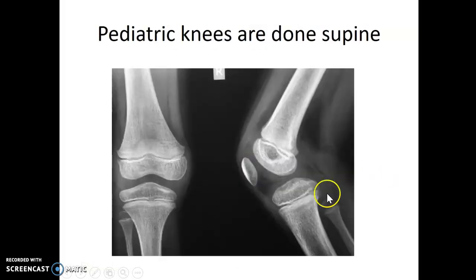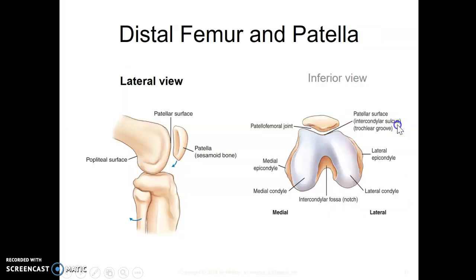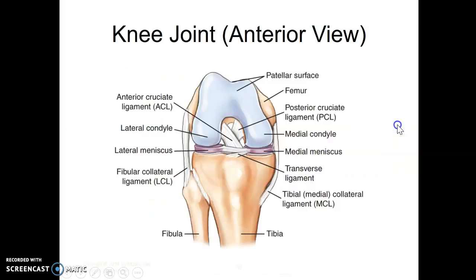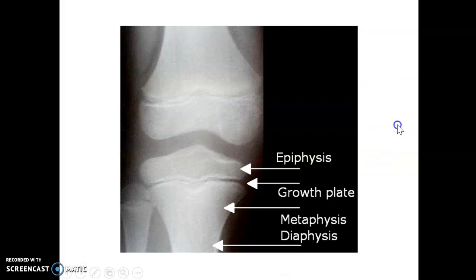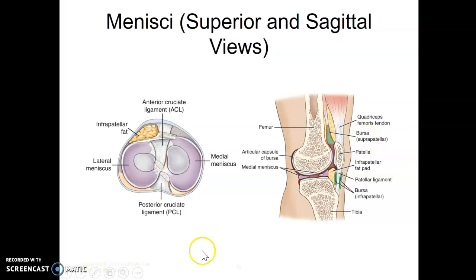Pediatric knees are done supine. You can identify that these are pediatric knees by the epiphyseal growth plates that are still open. Know your knee anatomy. I'm going to flip through here. I don't think I have any more. Okay, I'm going to skip that there.